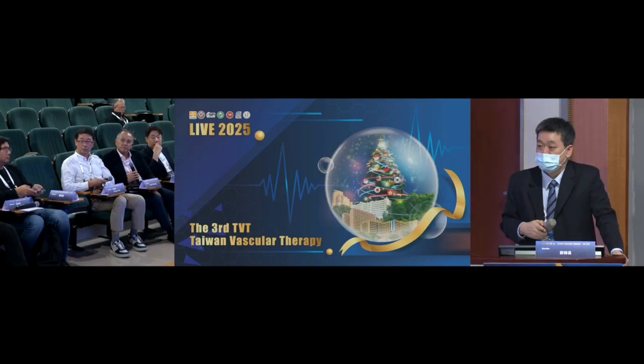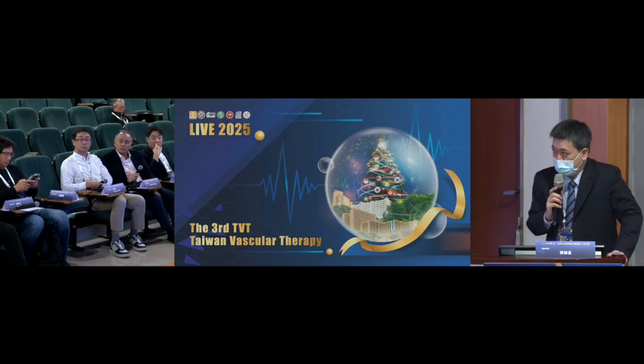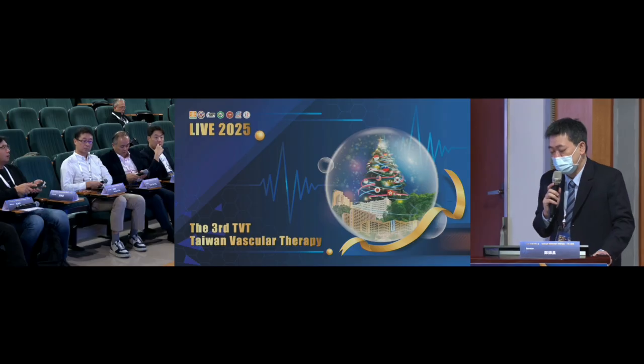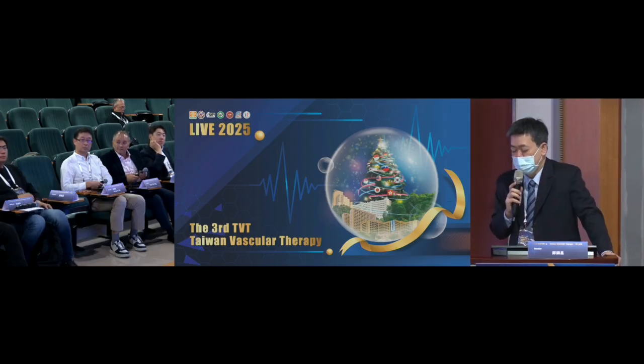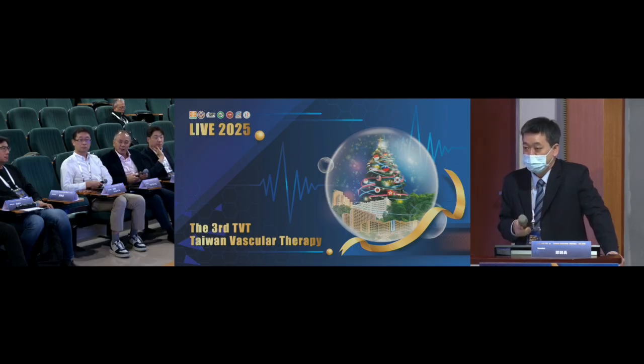Any special balloons that you use, or do you just use a normal semi-compliant balloon, or high pressure? No. For the first time, I usually use the 2 millimeter semi-compliant balloon, not the non-compliant balloon.